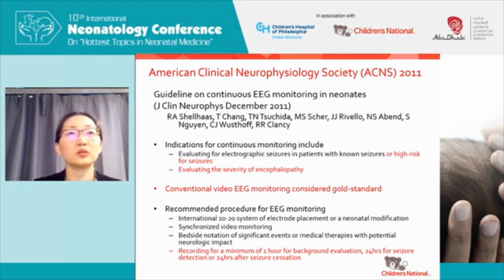It is also a good screening tool for seizures, in terms of telling you which patient might be seizing. And if there are infants that are at high or low risk, but you are still concerned, you can use it as an effective screening tool if you don't have ready access to the EEG, or you want to minimize the cost, being that a full video EEG can be much more expensive than performing an A-EEG.